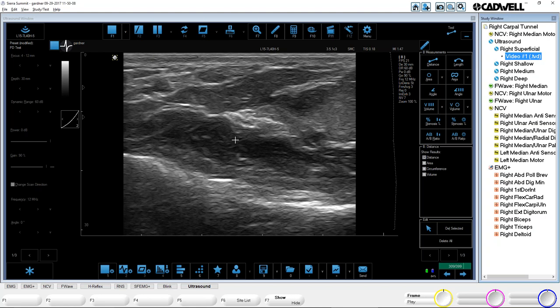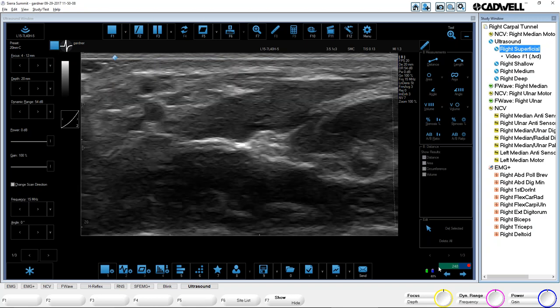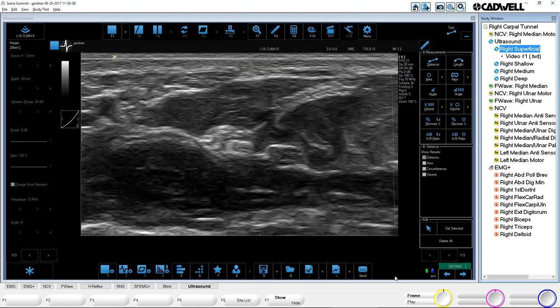Once you pause and find the best image, hit store to store that image. If they want to store the video — just like in EMG where they can store either the buffer or a snapshot — you can do the same with ultrasound. It's constantly recording over itself, so at any time you can pause it and go back to find the best image.